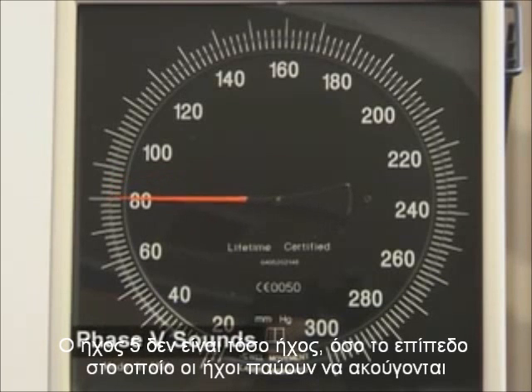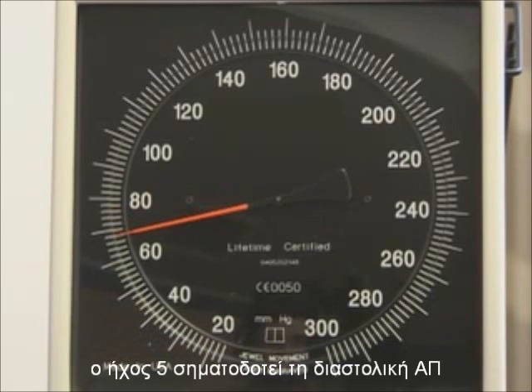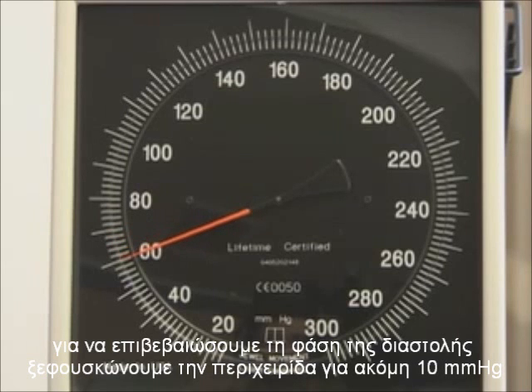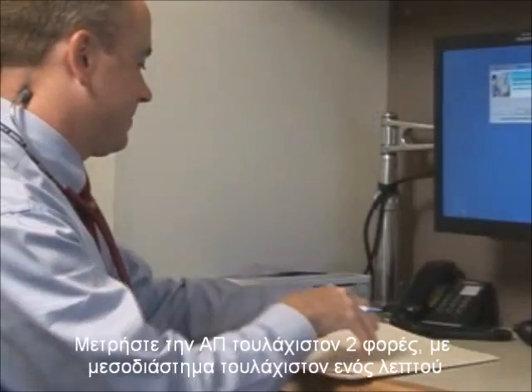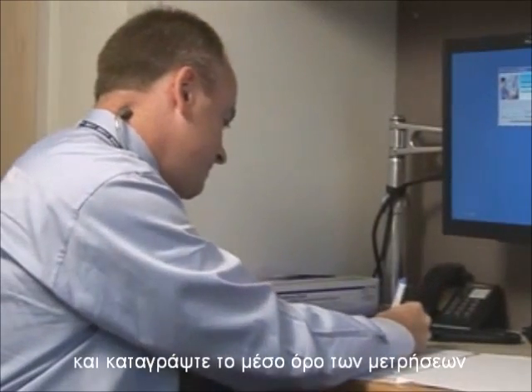Phase 5 sound is not really a sound, but rather is the level at which sounds disappear. Phase 5 indicates the diastolic blood pressure. To ensure that diastole has been reached, the cuff pressure should continue to be deflated for an additional 10 millimeters of mercury beyond the 5th Korotkoff sound. You should measure the blood pressure twice at a minimum, waiting at least one minute between readings. The average of the measurements should be recorded.